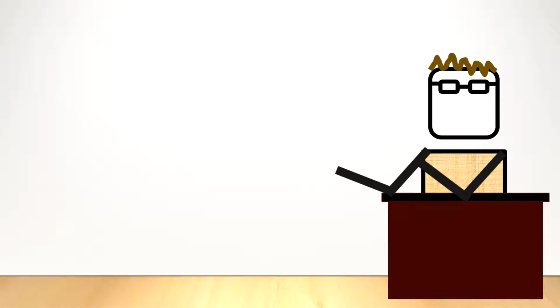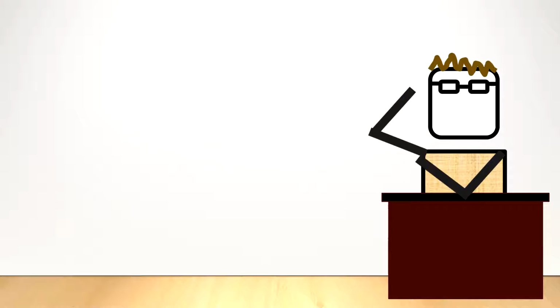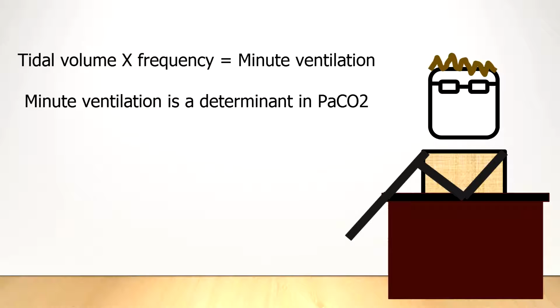Volume mode ventilation is by far the most popular mode of ventilation in use today. This is because it guarantees a constant volume, which, when combined with a set rate, gives you a guaranteed minute ventilation. As you should recall, the combination of a tidal volume and frequency gives you your minute ventilation, which is a primary determinant of your carbon dioxide levels in your blood.